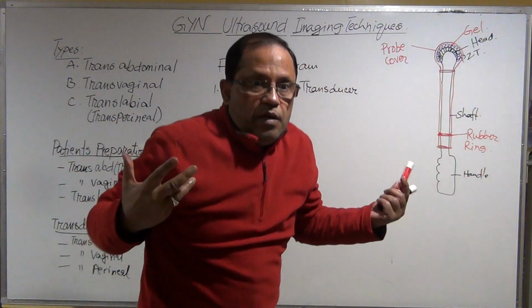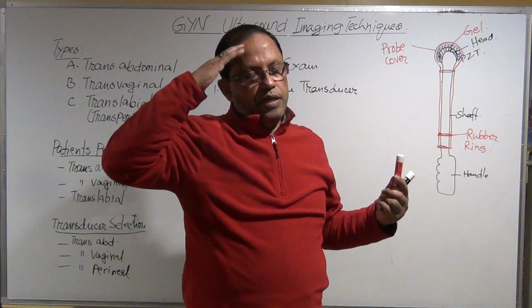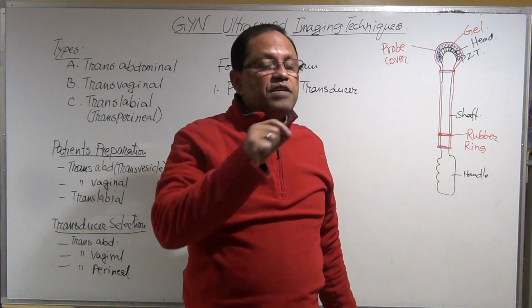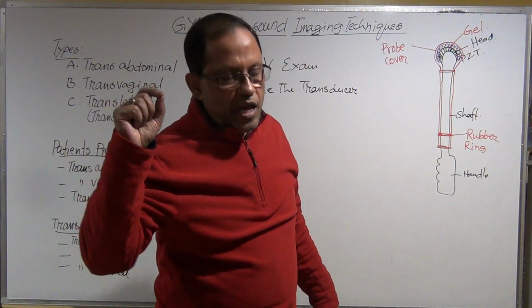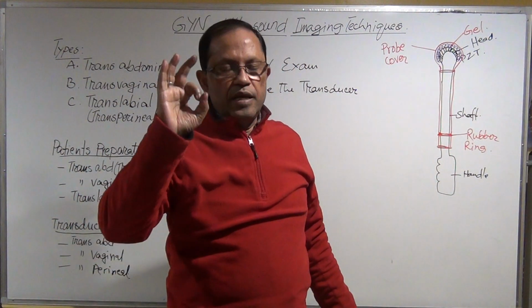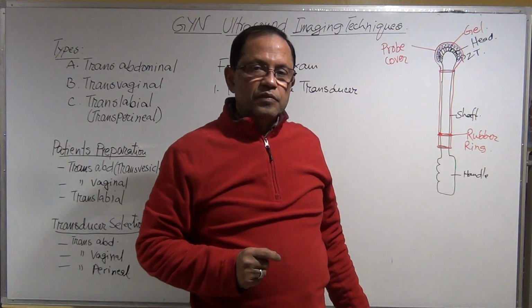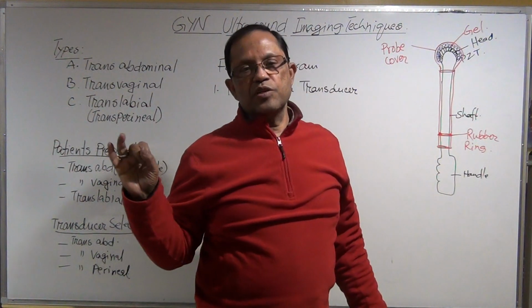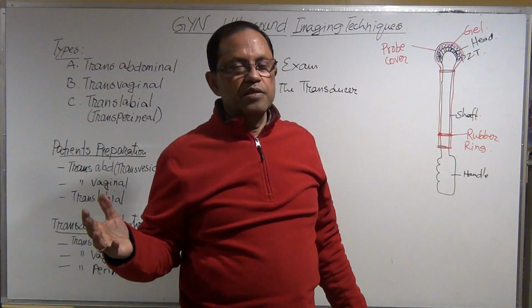The patient can be overwhelmed. Oh my God, what is this? It is going to go inside? Okay. If this is the first time, the patient will be nervous, but assure them it is nothing more than a big tampon. And the patient usually doesn't get any bad feelings.